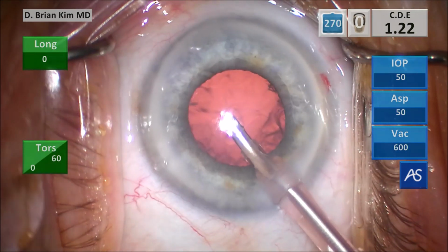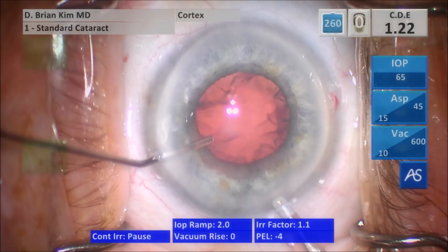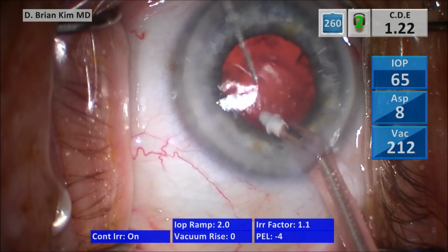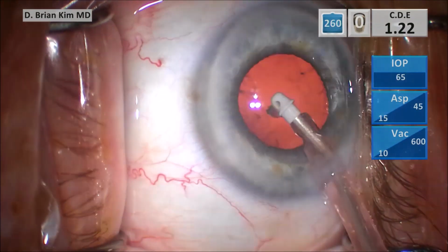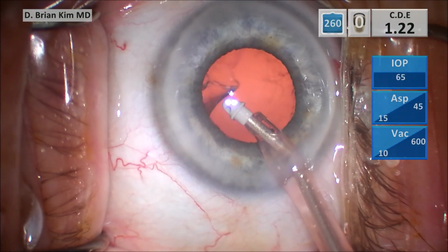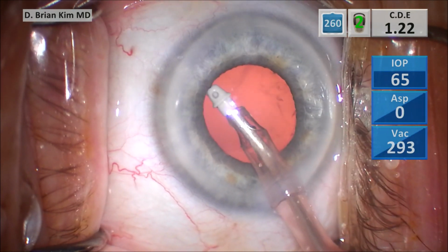So I take the chopper out, push BSS in, take the phaco tip out, and I go in with the I/A handpiece. And I made sure that the iris wasn't going to prolapse. This is not really an IFIS iris, so I didn't feel like that was going to happen. So I use the I/A tip, starting subincisionally, removing the cortical material, and then going around circumferentially, again trying to grab the anteriormost part of the cortex as I go around.